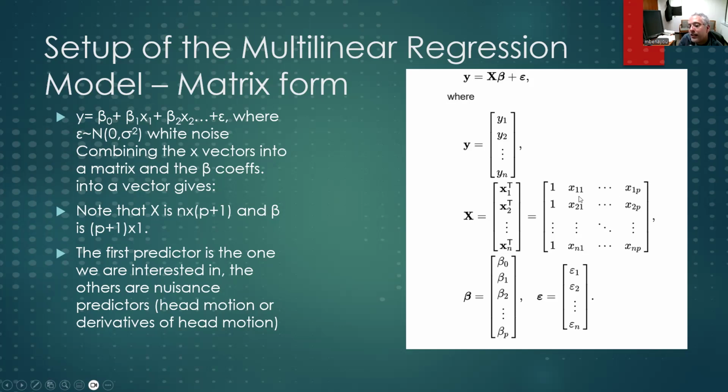That would help you by realizing that maybe the beta value for the one you care about, the ideal, is closer to 0 than you thought, because without including these other motion related time series, you didn't capture the best model that could explain all the data. It might show you that you were putting too much of the weight of Y on the ideal that you're going to then say is responsible.